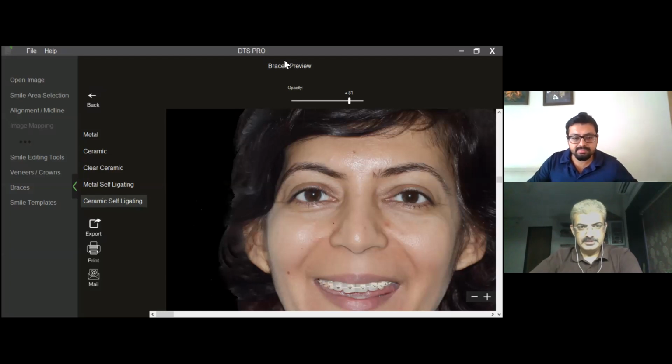Somebody is asking, how can this help in teleorthodontics? These are days where more and more virtual consultations are happening.